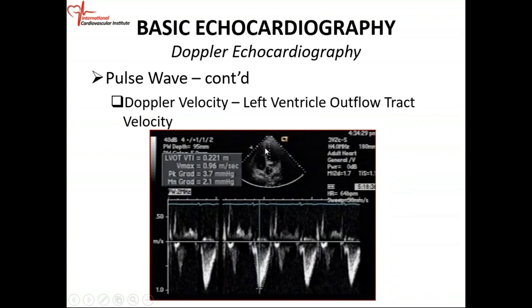This is the apical five-chamber view. Your cursor is right there, and the sample volume is in the left ventricle outflow tract. You press your pulse wave button and you get a spectral envelope — it's below the baseline and it's in systole. Systole is from the beginning of the QRS to the end of the T wave. You get periodic systolic flow because blood flows from the left ventricle across the LVOT, across the aortic valve, into the aorta. This is your LVOT velocity or LVOT envelope — the left ventricle outflow tract envelope.